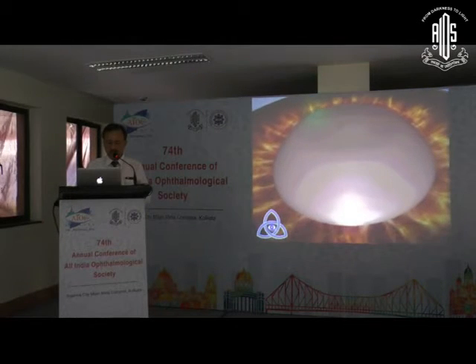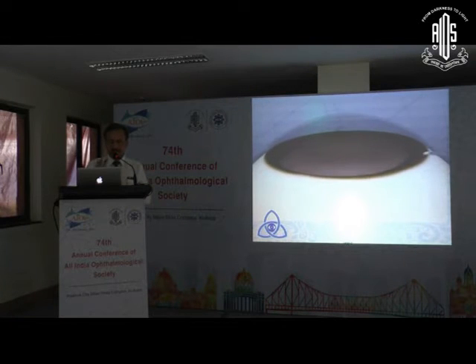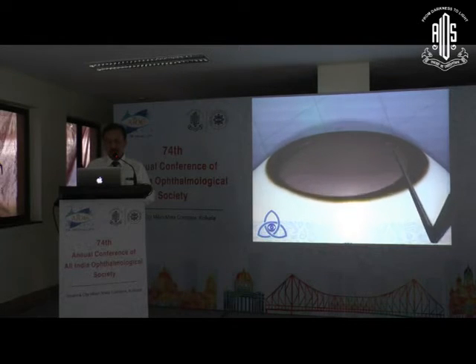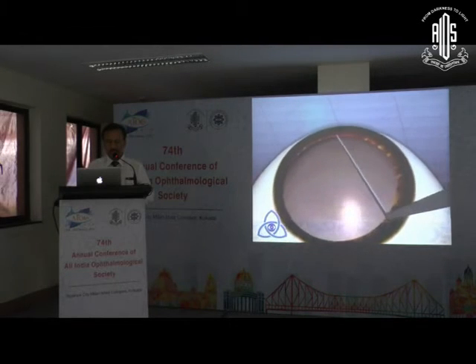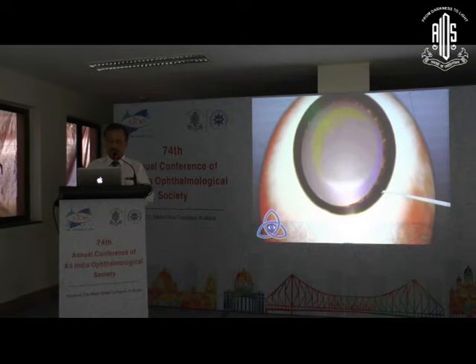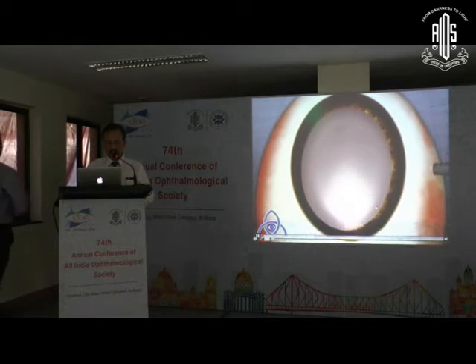In a very hard cataract, the most important thing, if you want to apply the terminal chop, is to achieve a good large rhexis. The rhexis is very important, and it has to be a little larger than 5.5 millimeters, not larger than 6 millimeters.